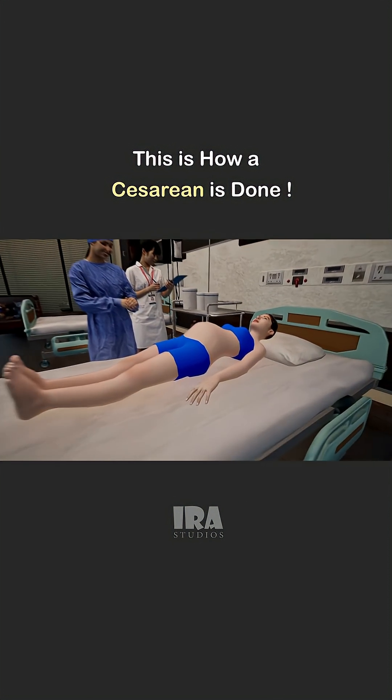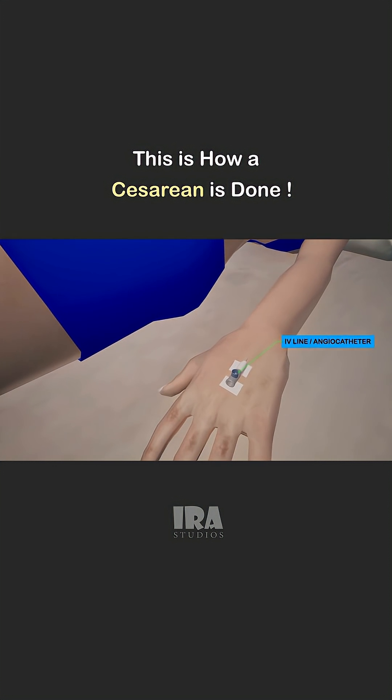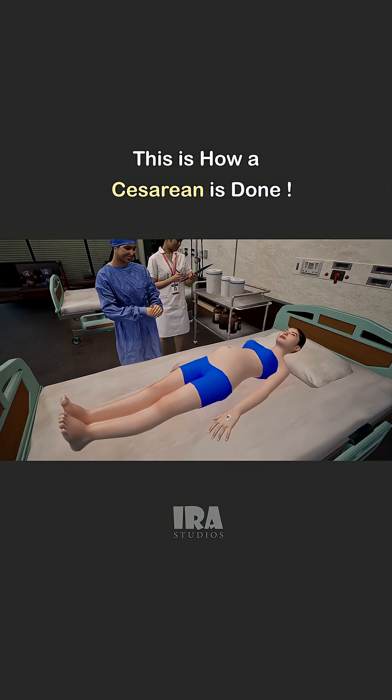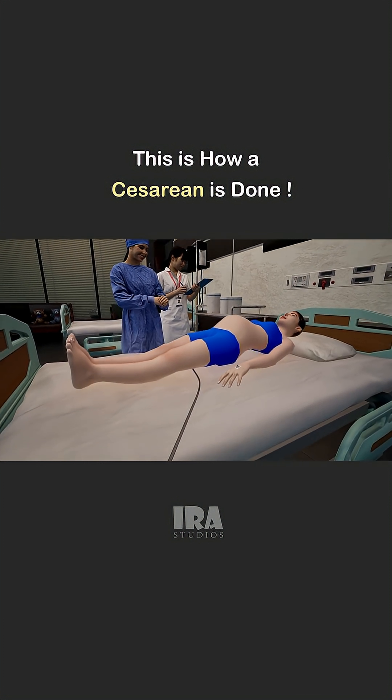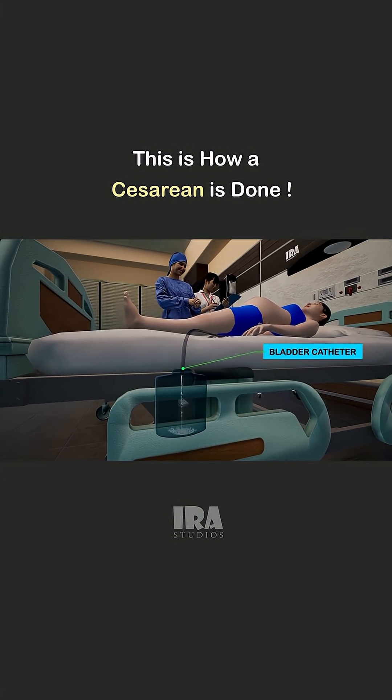Let's take a look at how a C-section is done. Before surgery, the mother is given an IV line, a flexible tube inserted into her hand or arm, to give fluids, medications, and anesthesia. A urinary catheter is inserted into the bladder to drain urine and monitor kidney function during and after surgery.